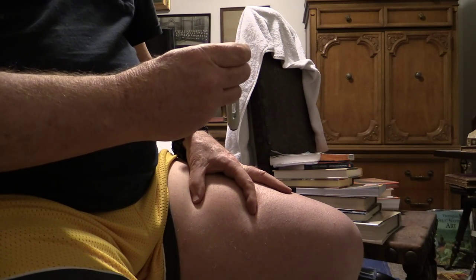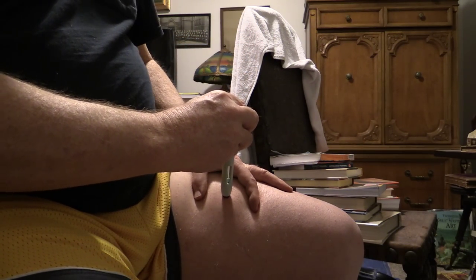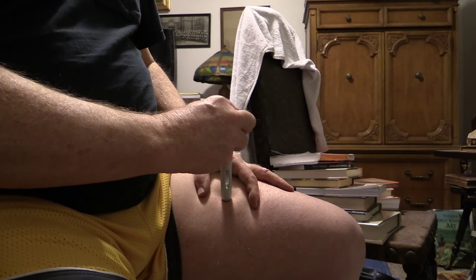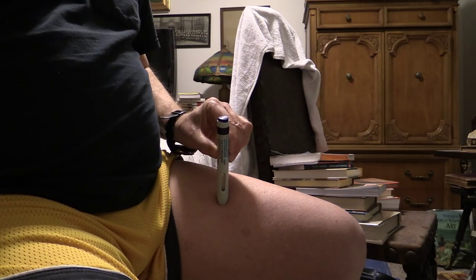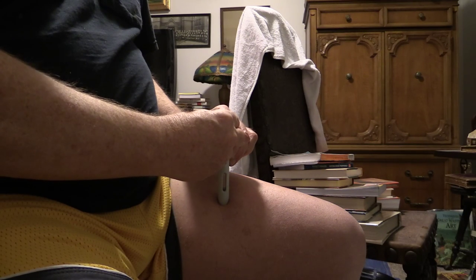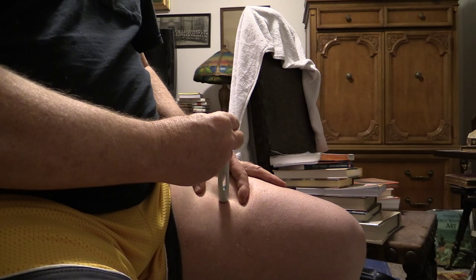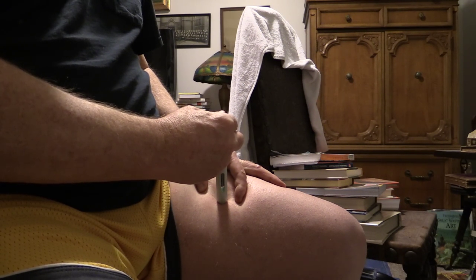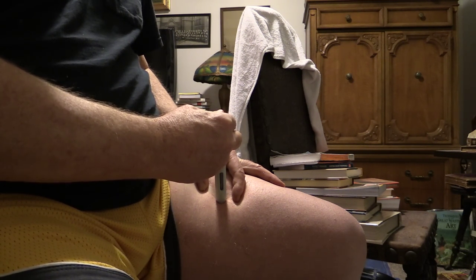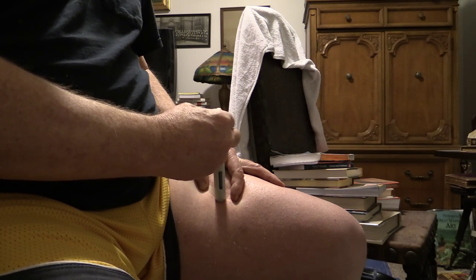You can see through the sides on this. You put it right on your leg like that, push down kind of firm. I get it firm like that, spread the skin apart a little bit, and then push it. I count to twenty — one, two, three... all the way to twenty.